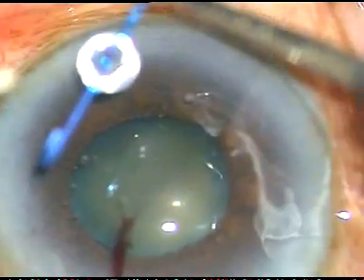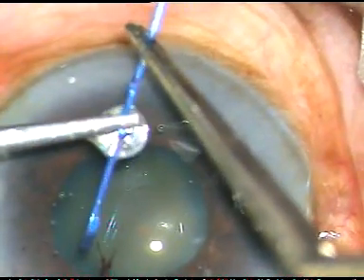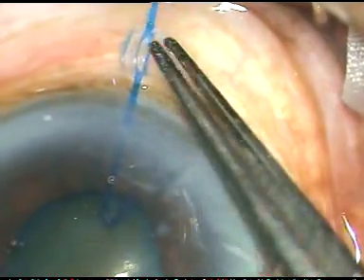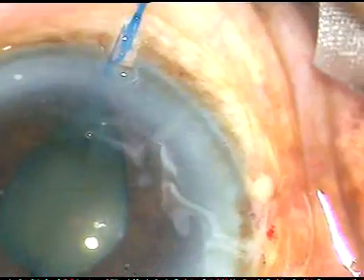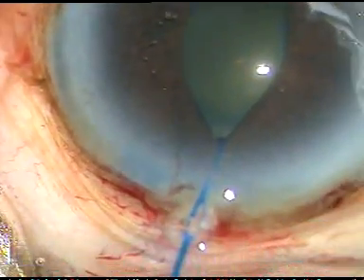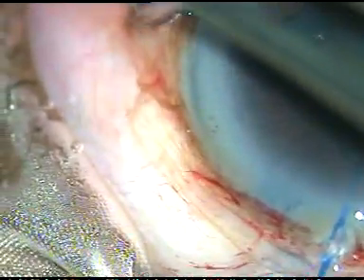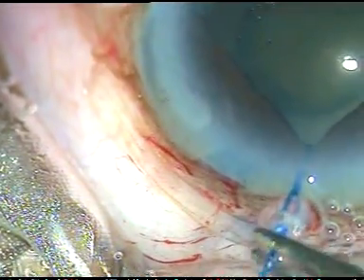See how to apply the hooks. This is the silicone guard. The silicone guard is retracted backward. Now the hook is introduced through a stab incision. The hook is rotated so that you can hook the margin of the pupil. Advance the hook so that the iris remains retracted. In this way, another hook is applied at 12:30, the third hook at 9:30, and the fourth hook at 3:30.